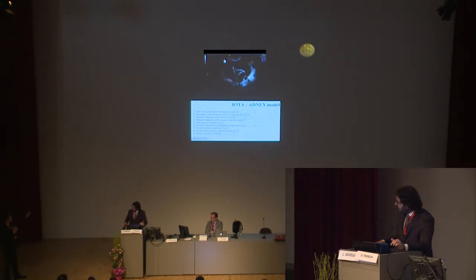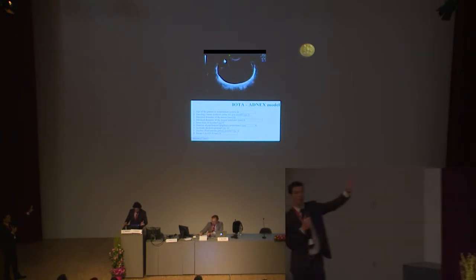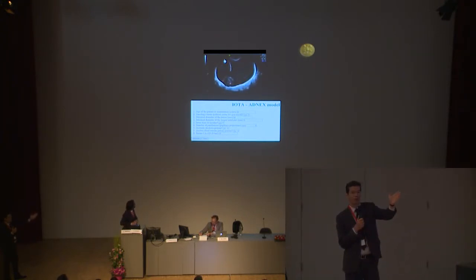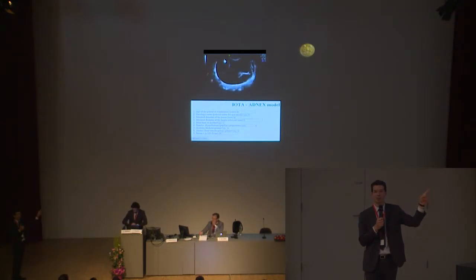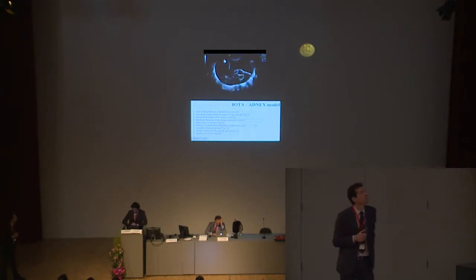For this, I'm happy that you show a clip, because in some images it seems that there are solid parts, but if you move along, then you see that there is no solid part, but this is simply the angle, because if you're really along with the septum, then it seems that there's some solid part. So artificially, you can make it look like a solid part in a multilocular cyst, but if you have a clip, then you can see that it's completely multilocular, with no solid areas.